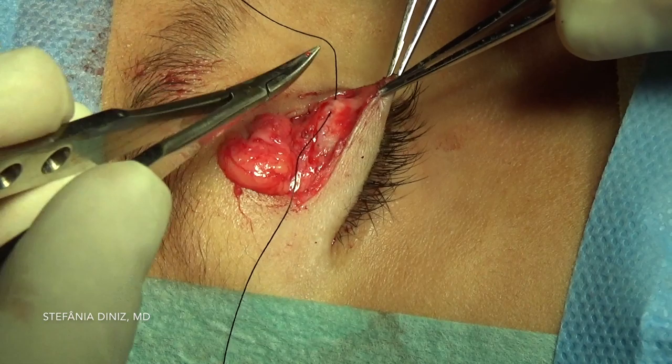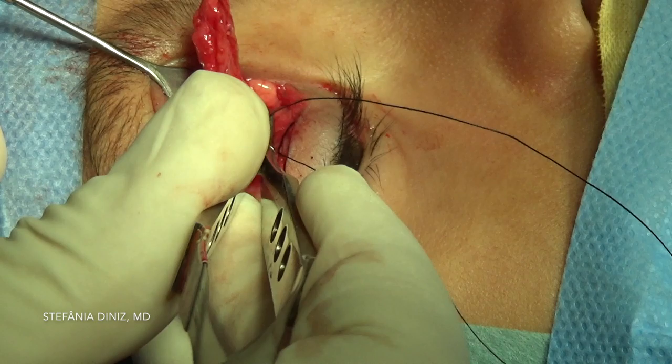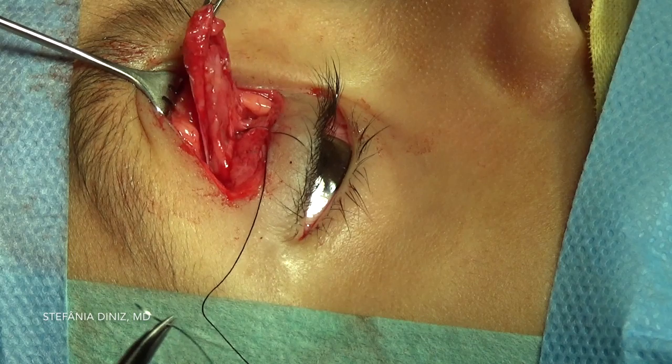A double-arm 6-0 silk suture is placed partial thickness through the anterior surface of the tarsus, with care not to violate the conjunctiva. The suture is then placed through the levator aponeurosis at the desired distance.